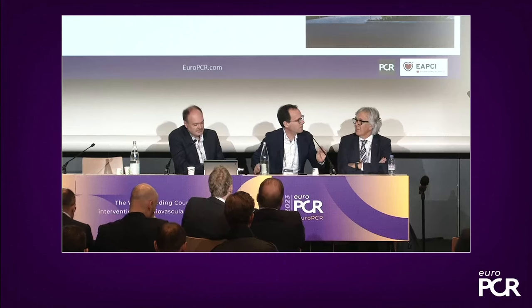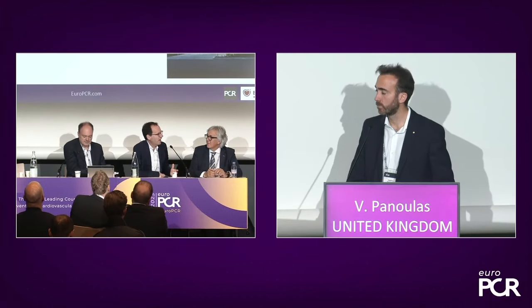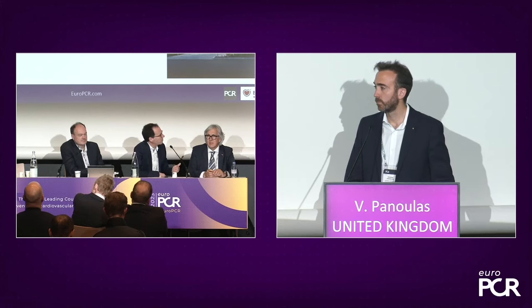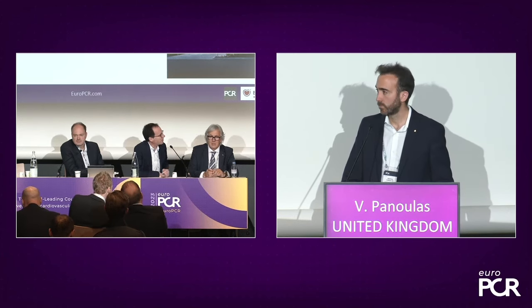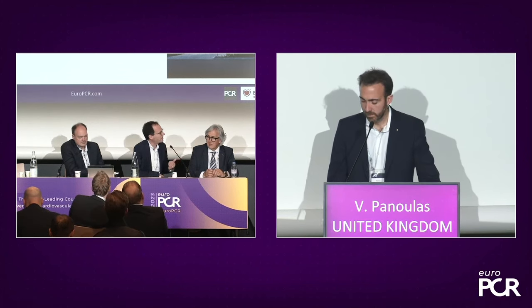I have also another question. Completeness of revascularization is very important. Can you also retrieve data on the quality of revascularization, which is also a very important point? So do you have extensive lesion preparation beforehand, because these are all calcified lesions, like use of rotablator or any other procedures? I think the quality is something, and the extent in addition.